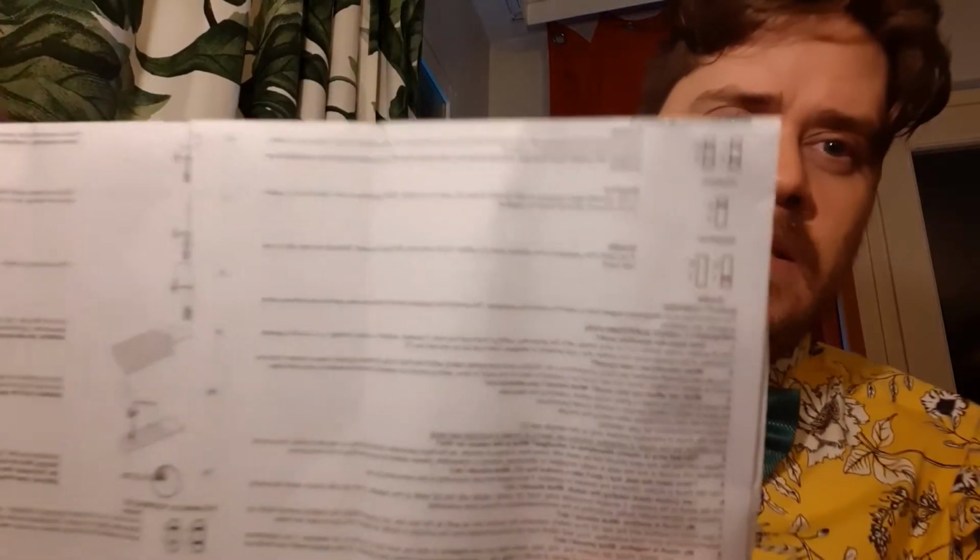Now, if you get 2 colored bands, so one shows up in control and one shows up in test or T, then no matter how faint that colored band is in the test zone, you should consider that a positive result for this test. Every single test is going to have a slightly different setup, but what I'm talking about you can see right here. So that top section, it's a little blurry, but you can see top line is C, bottom line is T. Even if it's real hazy, if you see anything in T, consider yourself to be infected. Wear your masks, get medical help, consult your local regional medical services to figure out exactly how that's done, but do something. Don't infect other people.